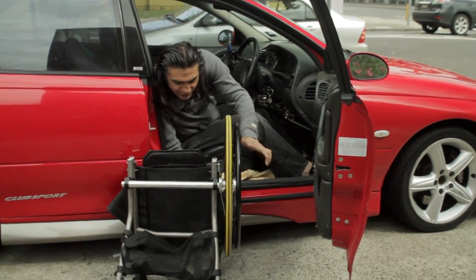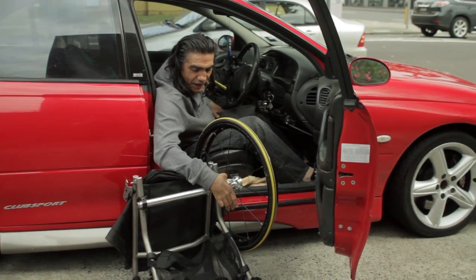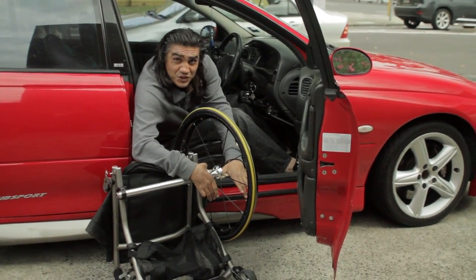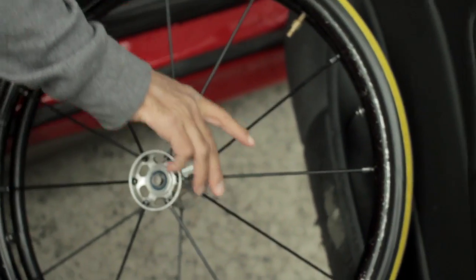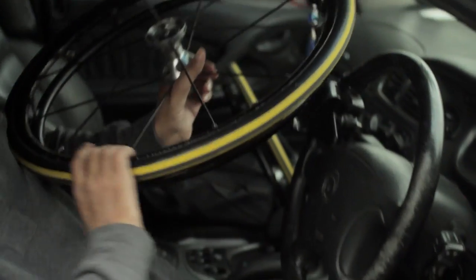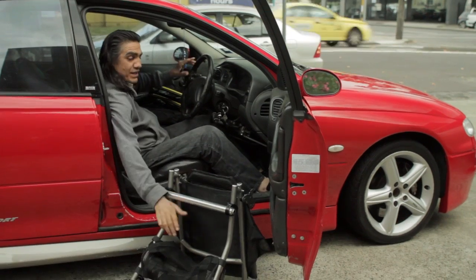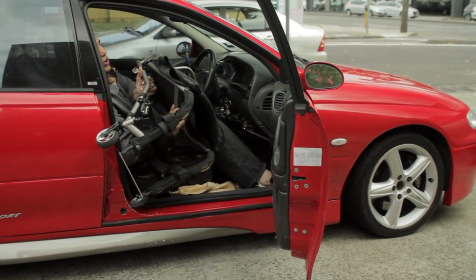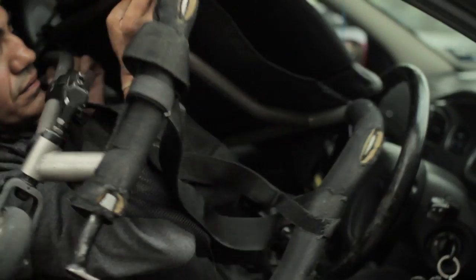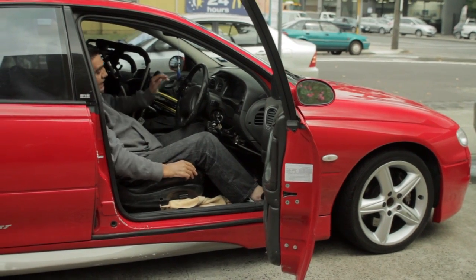And I'll just fold the backrest down and take the wheel off the same way as I did the other one. So I've got one arm between the wheel and the frame of the wheelchair, and with the other hand I'll just press the button to release the wheel and then just pop that off. And then just depends, I either put the frame of the wheelchair onto the passenger seat, or I can put it onto the back seat. And that's pretty much it.